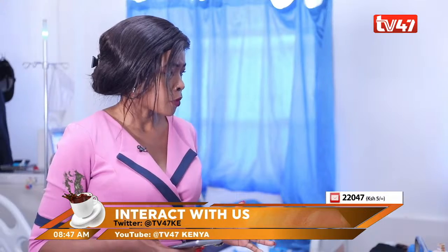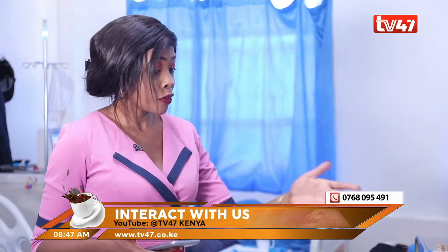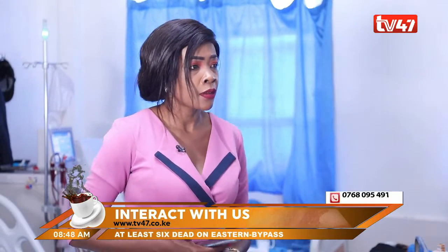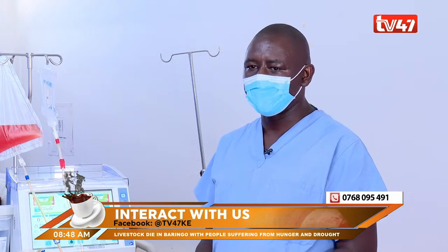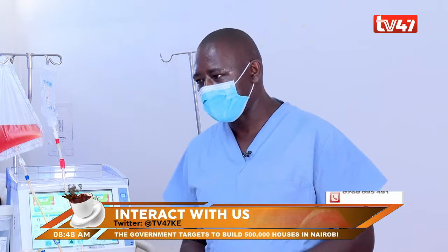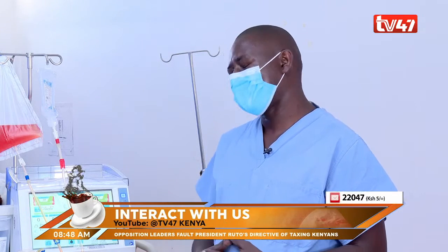Once someone marches into this unit, what happens? Say I'm supposed to undergo dialysis. In the first experience, we usually have a counselor who explains the procedure to the patient, so when the patient comes, they know what is supposed to happen. Most patients come and take their weight; we settle them in bed, do their blood pressures to see how their pressures are doing, and we do blood sugar if they are a diabetic patient. Then we proceed with the procedure.